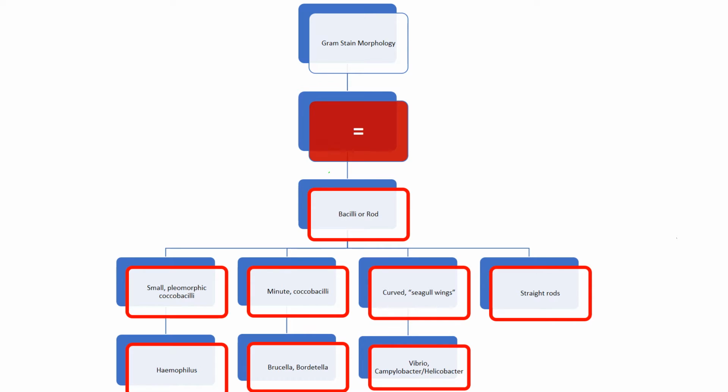Nevertheless, when you get to learn more about each of the different species, there are certain unique characteristics, even in their microscopic morphology, that you would eventually become familiar with. And this takes practice, practice, practice. Looking at the images, looking under the microscope when you get to the clinical laboratory, and be able to correlate a particular organism with a specific morphology. That should provide you with a starting point.